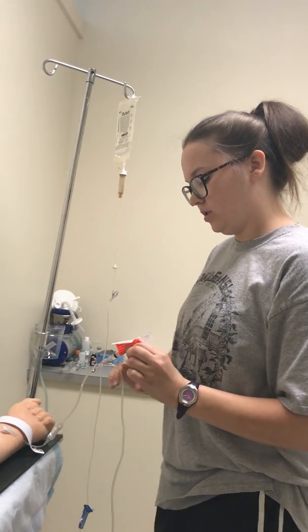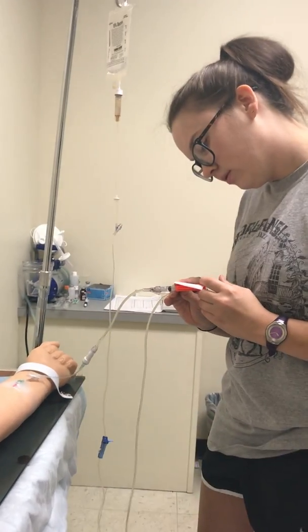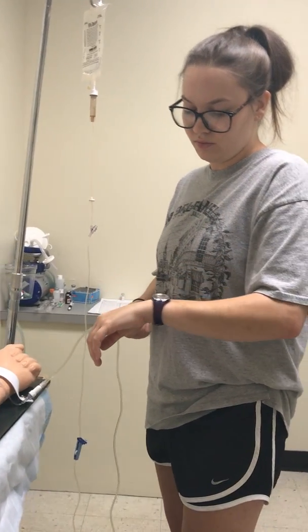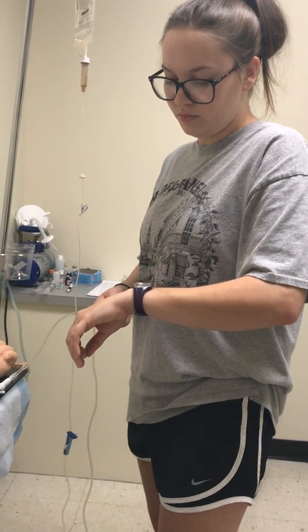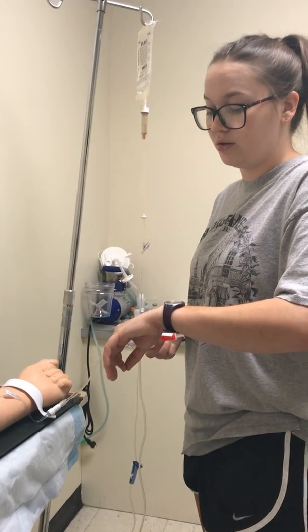Okay, gonna administer the next one. Kink the tubing again. A little over 1 milliliter. I'm kinking the tubing. And while I'm doing this, I'm still going to assess my patient's respirations, make sure it doesn't get too low.